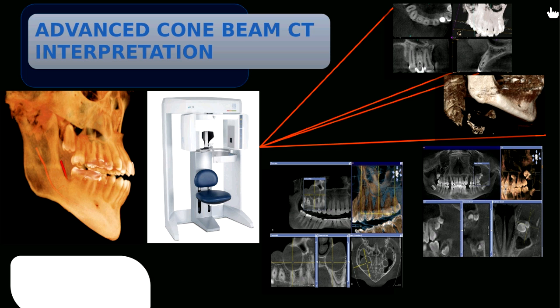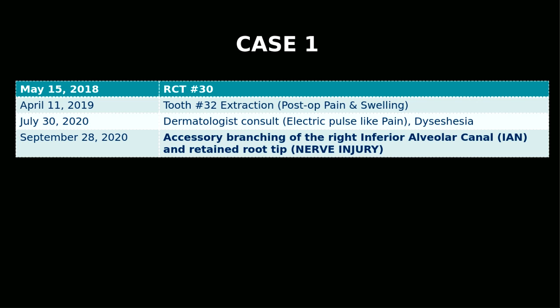The important thing about interpretation is that taking radiographs is pretty good, but the real learning is about really understanding the images and your clinical scenarios, and how you can use it in your clinical practice. Let me start with a case which I saw this Monday.